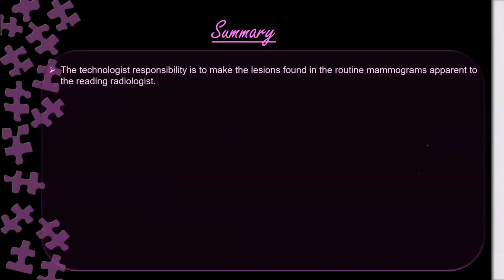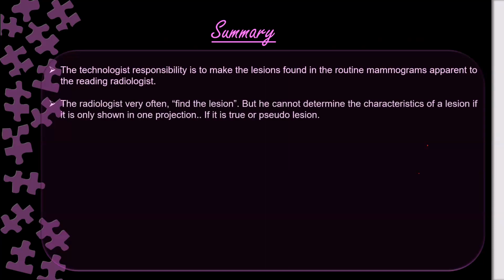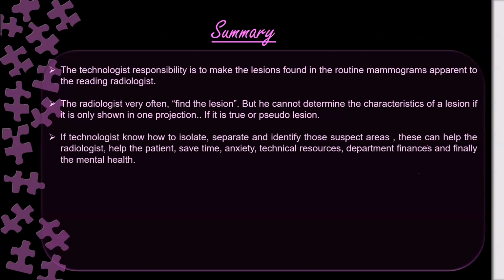The technologist's responsibility is to make the lesion clear in the routine mammogram, to make it apparent to the reading radiologist. The radiologist often finds lesions challenging, difficult to determine and to characterize, and to make sure whether it is a real lesion or a pseudo lesion.